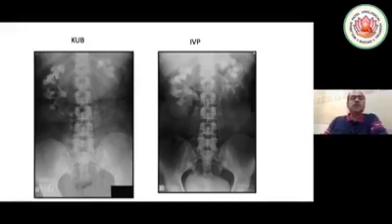Now if you have to focus on the right side, how would you make a puncture if you have to really do supine PCNL, and how would you take care of the liver? Because in upper calyx, such a high, in prone there is a problem of pleura, but in the supine there's a problem of liver. So how do you take care of that? And what is your message?